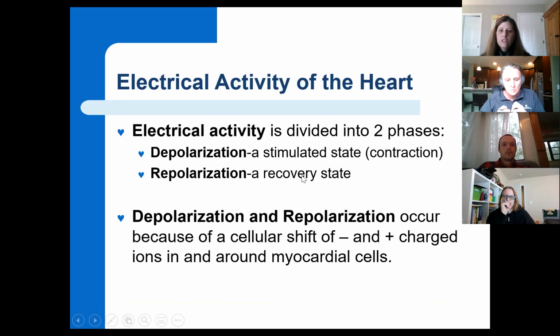The depolarization is going to be the contraction of the heart. And the repolarization is when it's just an ever so brief moment where the heart is resting, it's recovering, getting ready for the next contraction. Okay? And we'll talk about that when we look at the EKG strip and specifically talk about what's happening where. And if you watched your 4 videos like you should have watched before this lecture today, some of this should already be making sense.